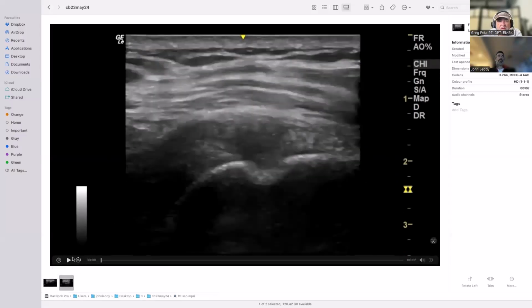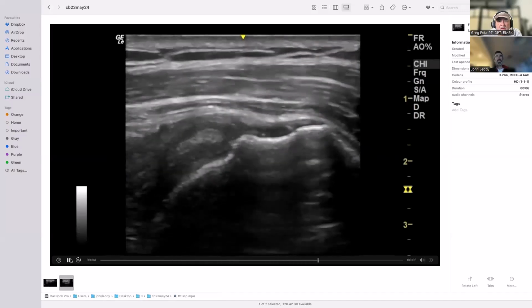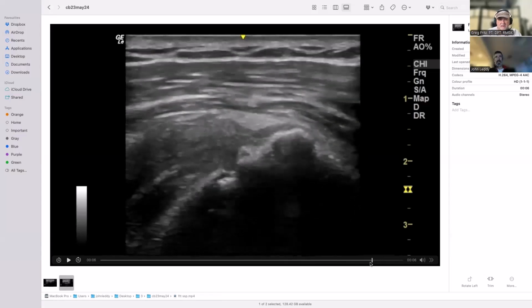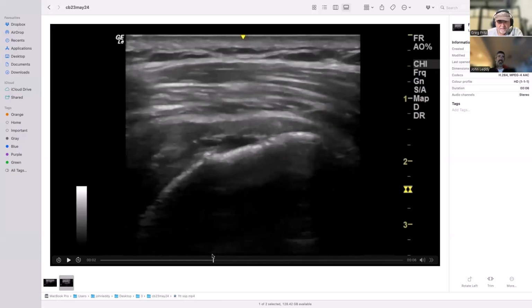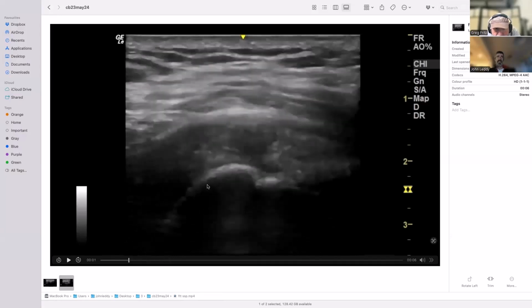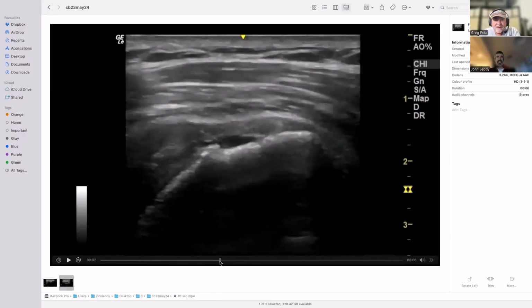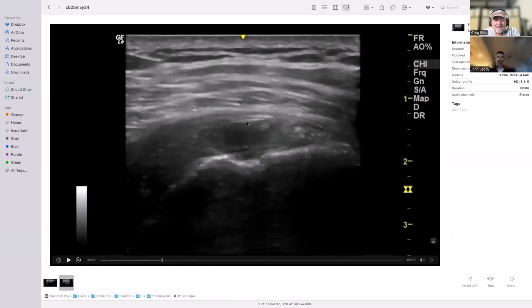If my memory is good, this is just a pretty straightforward supraspinatus tear. But what I liked about it, which is why I saved the clip, is the way, hopefully you can see the infraspinatus tendon here just coming across and showing you that the tear is in that bit of supraspinatus at the back, the bit that gets covered by infraspinatus. So this is infraspinatus coming in obliquely here, that triangle there.